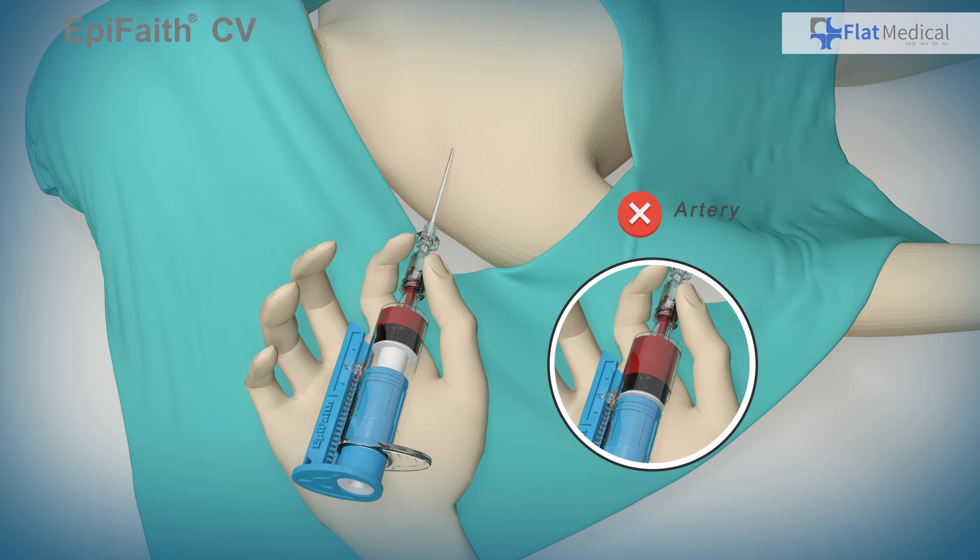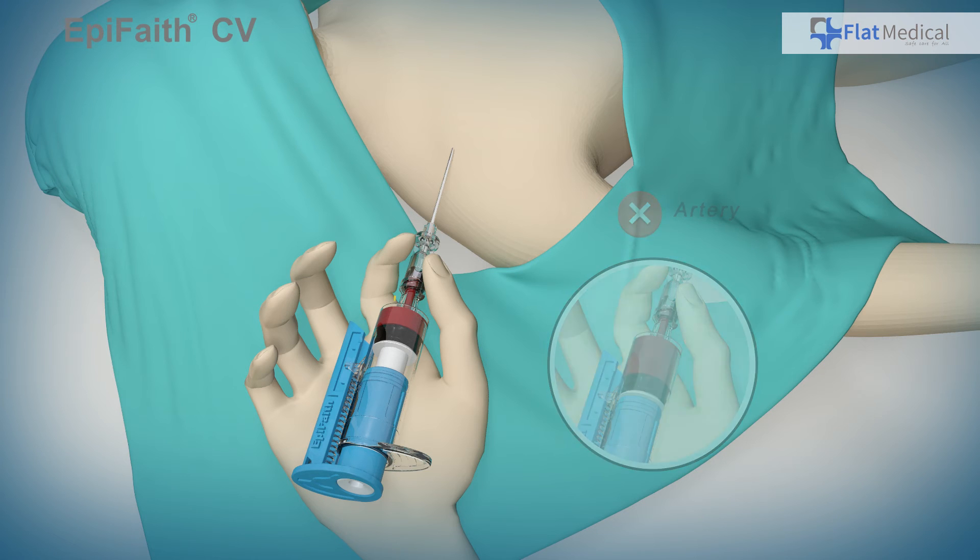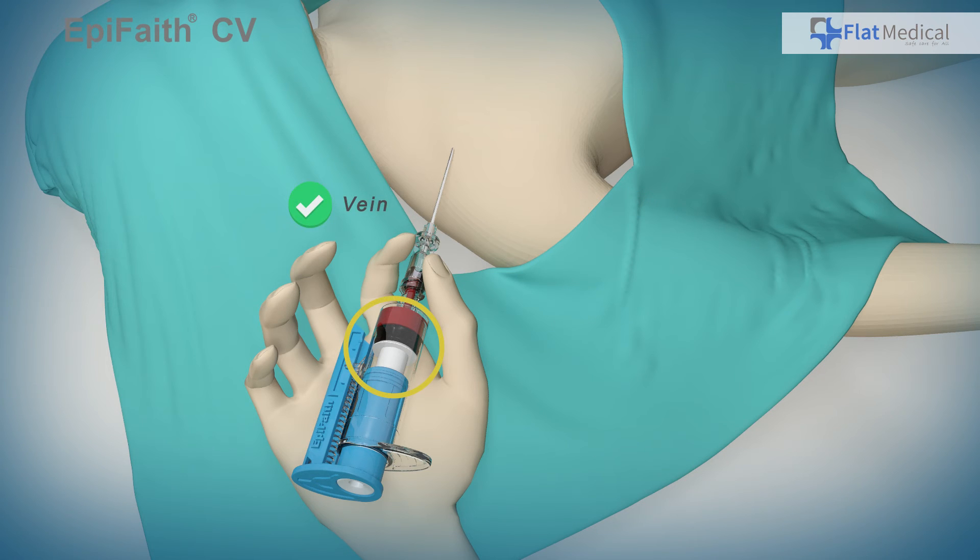The user is advised to stop advancing the needle and to initiate appropriate control measures. If the insertion into a vein is successful, the pressure indicator will not get covered even as the blood enters the syringe.